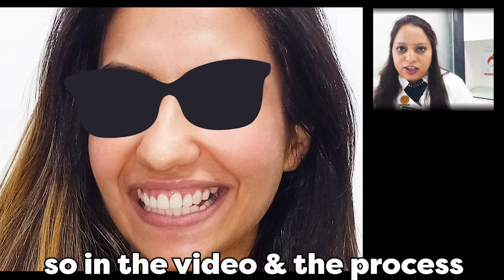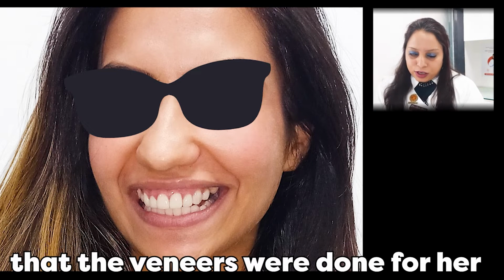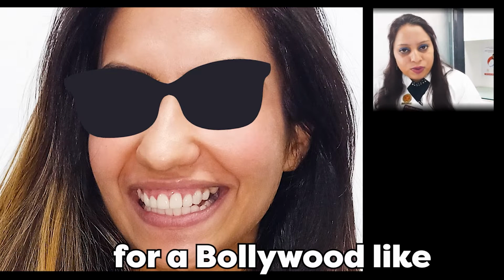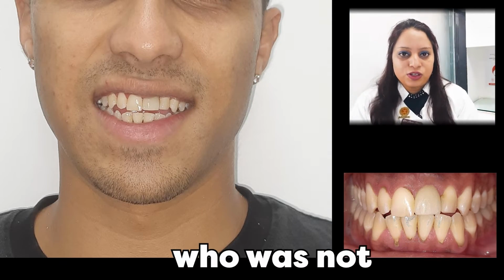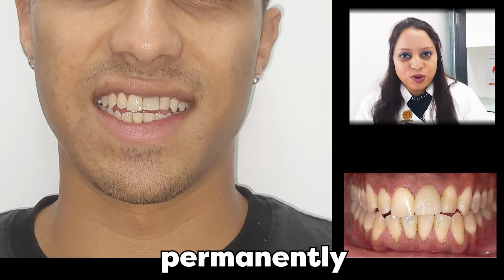So in the video and in the process, you will see the veneers that were done for her, and we opted for a B1 shade for a Bollywood-like brighter smile. Then next is 7 veneers and 1 zirconia crown done for a patient who was not happy with the shade and he wanted to get rid of the smoking stains permanently.